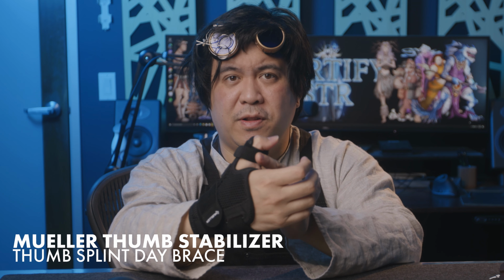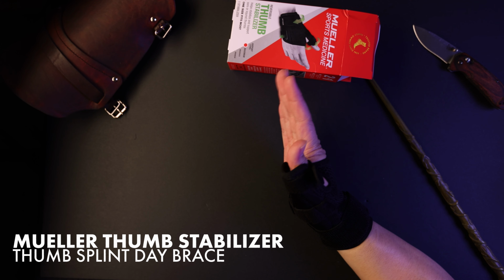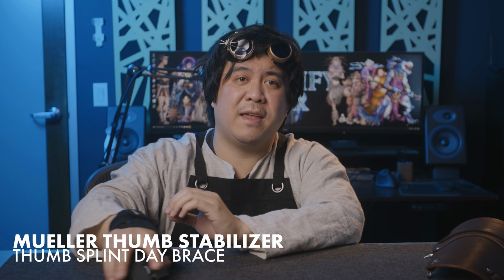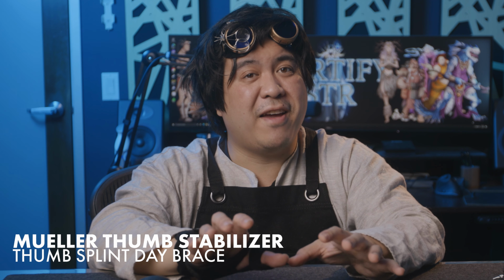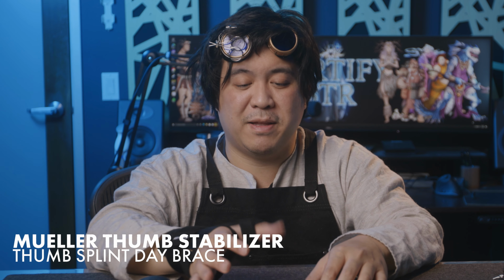It keeps the thumb neutral while also providing some support at the wrist to keep it from excessively flexing or extending. It does this while still keeping your fingers free for typing and using the mouse. There's a caveat here that you're going to need to learn to hit the space bar with the side of your thumb since it's splinted up.